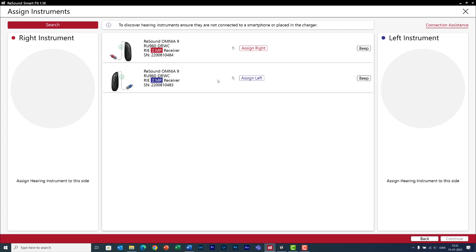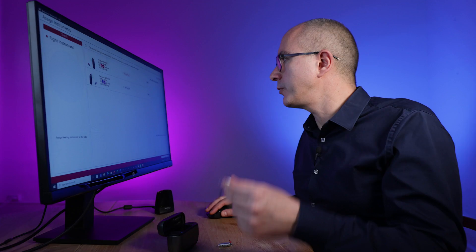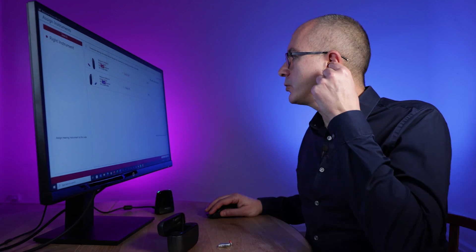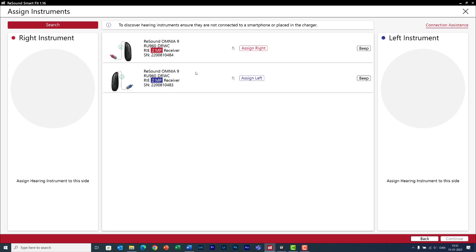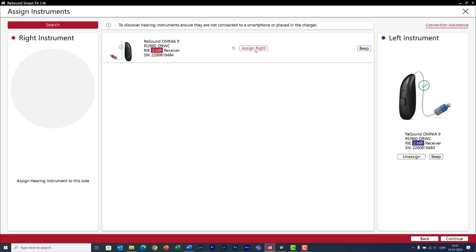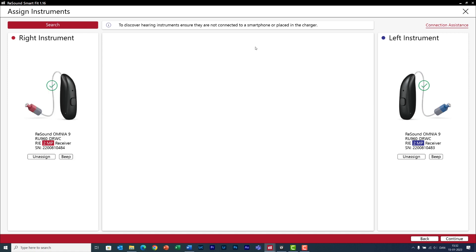But if you want to make sure that your hearing aids are correctly identified you can also beep them. For example this one like that. Now I can assign the hearing aids to the left and to the right and you are ready to continue.